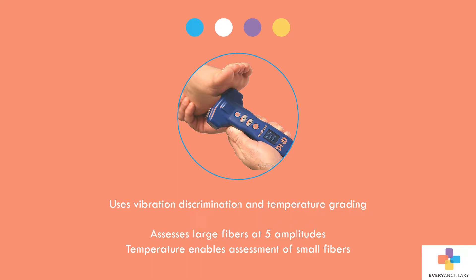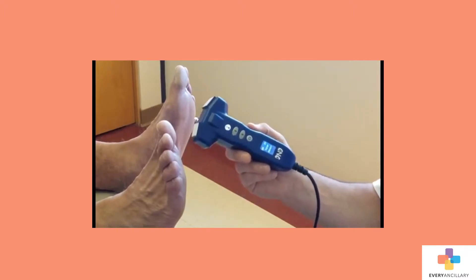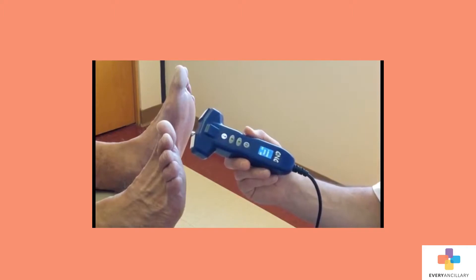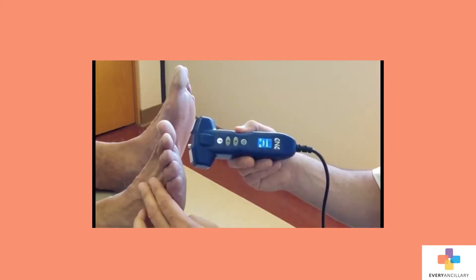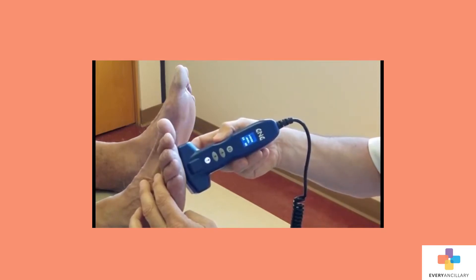Here's a demonstration. Now we're going to be performing a temperature discrimination screening. We're going to start with a 2 degree difference. Can you feel the difference between these two pads? No, I can't.